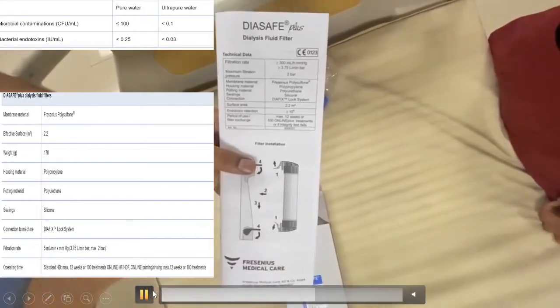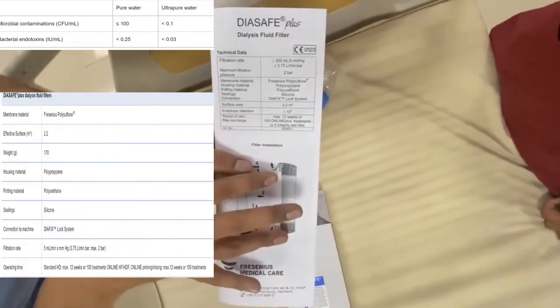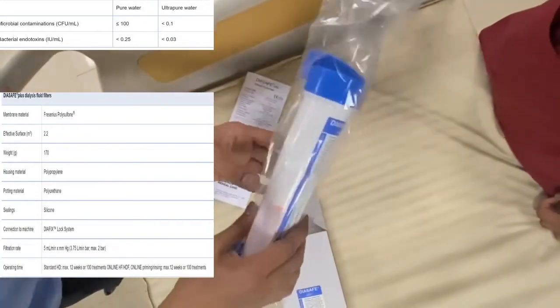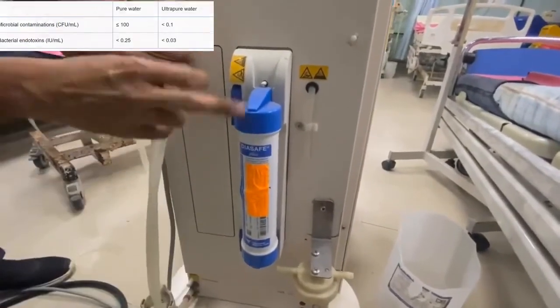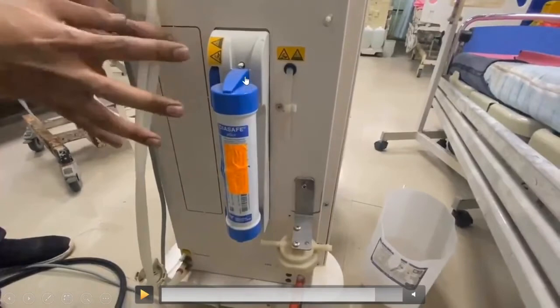It is very easy to attach the Die Safe to the dialysis machine. The seals at the inflow and outflow ports have to be removed, and it has to be slid through the place designated on the dialysis machine. It does not get permanently attached — it is just slid through the back part of the machine so that the water, before it enters the dialysis machine, passes through the Die Safe, producing ultra pure water.